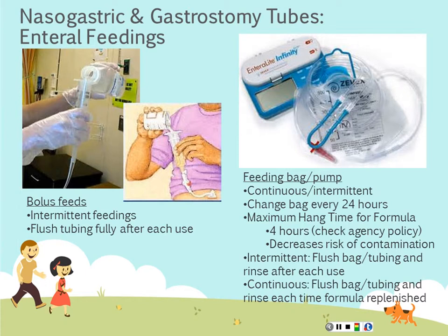So the biggest deal is the maximum hang time for formula is generally about 4 hours. So you never want to put more than 4 hours worth of formula into your feeding bag at any time, and then you want to rinse it out before adding more formula. That's going to decrease the risk and buildup of contamination. And always check your agency policy on that, because their maximum hang time may be less.